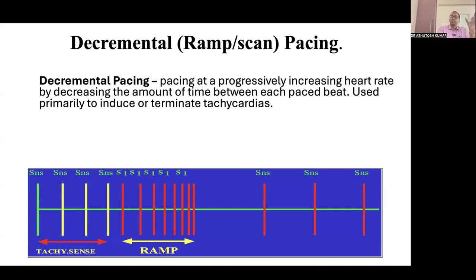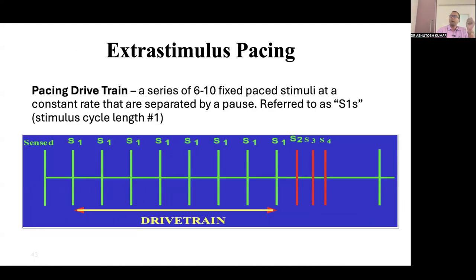And these are the ways, meaning we have to first sense, so the R wave has to be checked. If the R wave is good, we start. They use the words sync versus non-sync. It is very important that pacing should be done in sync, meaning you have to synchronize and then give it. Most of the time our technicians will say non-sync. That is not correct. You have to sense the normal rhythm and then give the extras. Otherwise VT or VF can happen unnecessarily. We want to induce, but sometimes it unnecessarily induces a non-clinical arrhythmia.